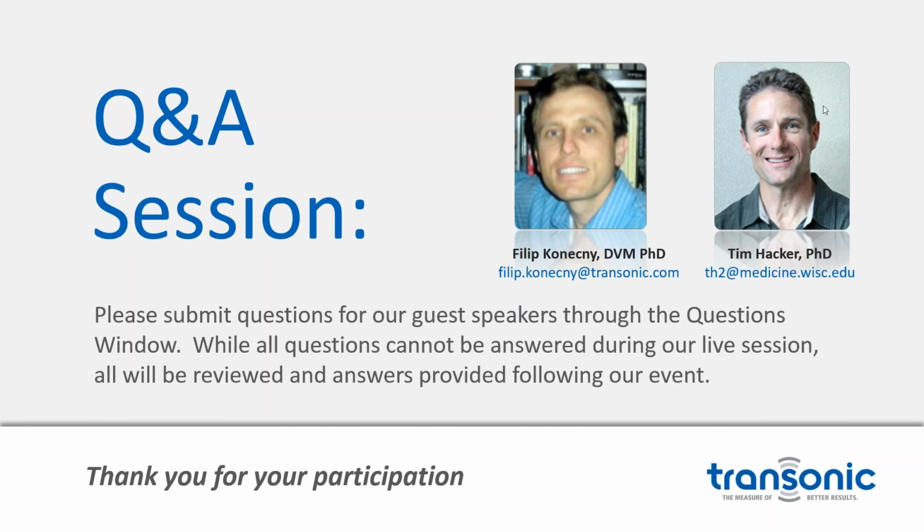Well, over the years, what I would say about VADs is that PV loop longitudinally evaluates the support, while you can fine-tune the device for a specific animal to work in synergy. What does it mean? It gives you live warnings if extreme cases of unloading occur. For example, I observed a creation of micro vacuum periods during unloading. With unloading, you're trying to push the RPM. Sometimes you're trying to capture the pump speed, but you don't look for other parameters, and then suddenly you have some micro vacuums created.